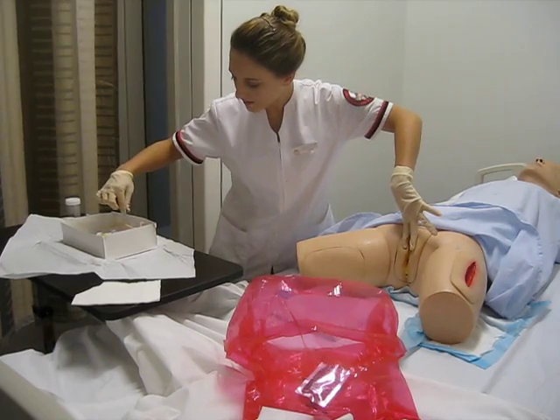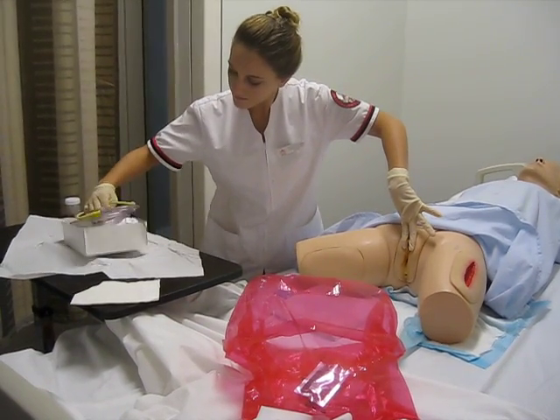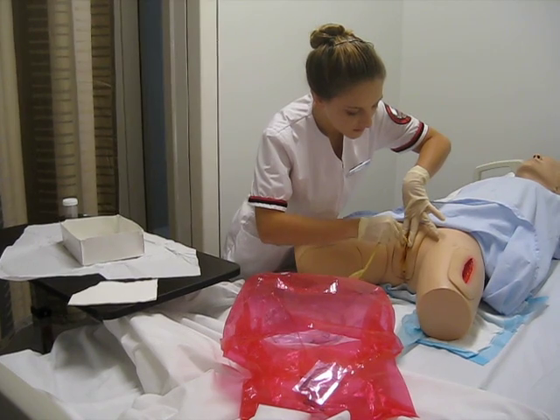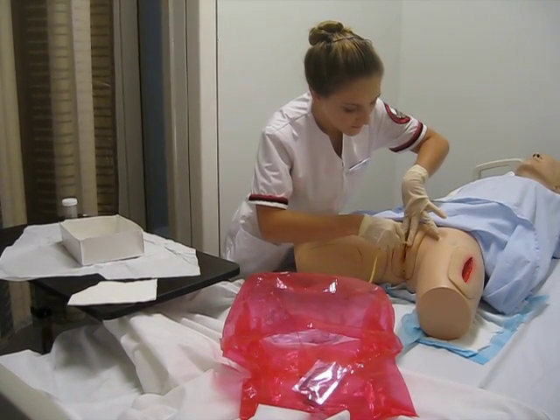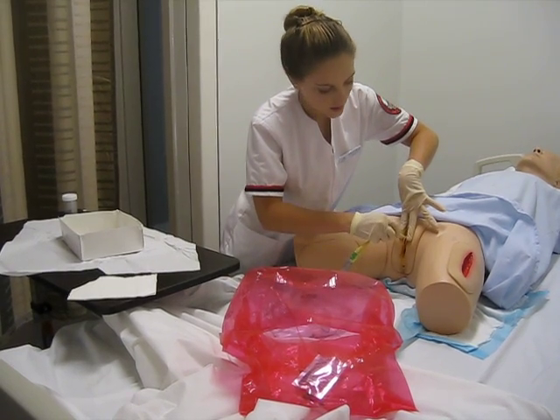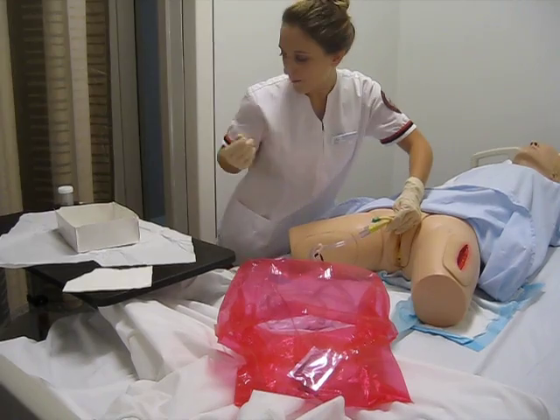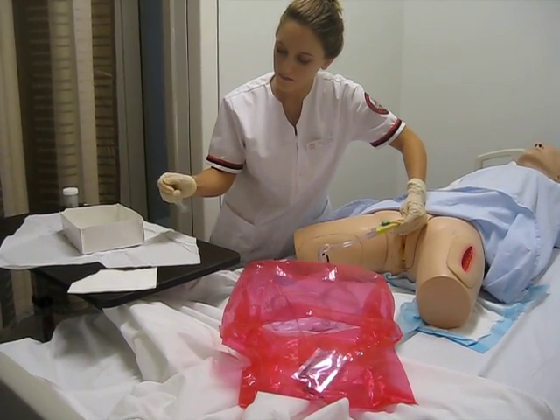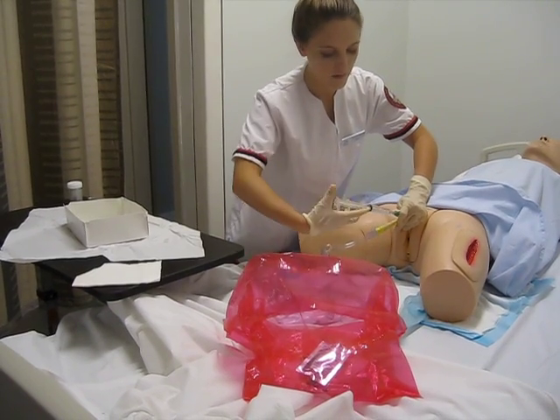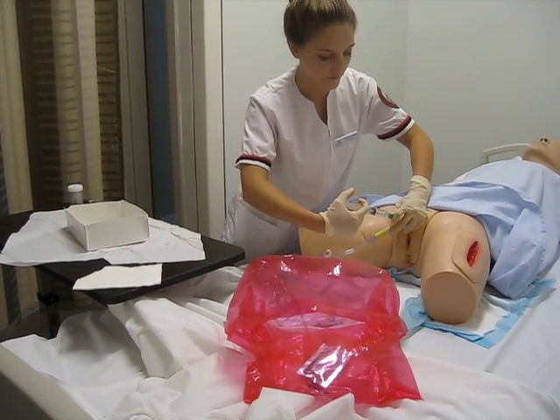Now I can insert the catheter. I will go ahead and lubricate the tip of my catheter and put this on the bed. I'm inserting this into the urethral meatus. Do you feel any pain? No? Great. I do see urine, so I will progress one more inch. I need to go ahead and inflate my balloon. I'm putting 10 cc of fluid in the balloon.